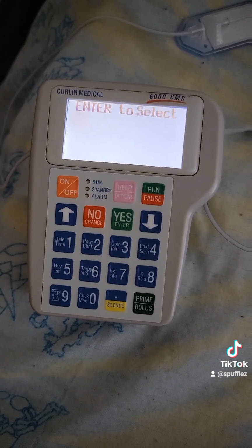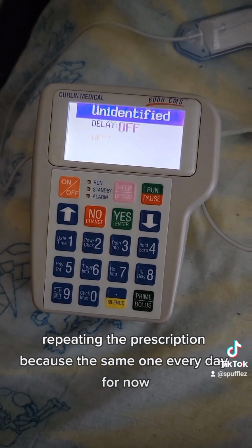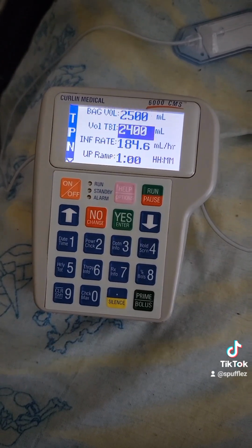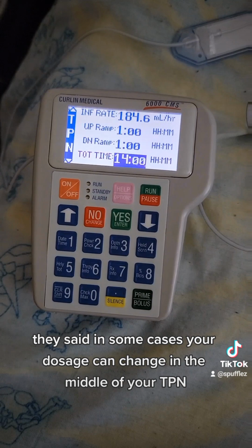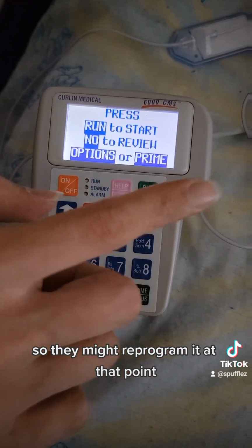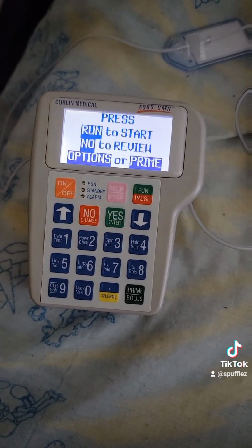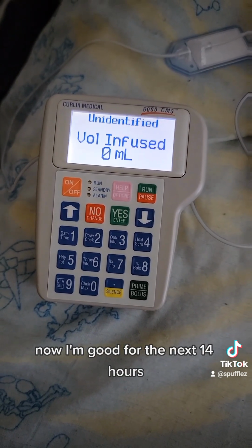Power. Go into the program, repeating the prescription because it's the same one every day for now. They said in some cases your dosage can change in the middle of your TPN, so they might reprogram it at that point. And then it says run to start. That's all we do. Now I'm good for the next 14 hours.